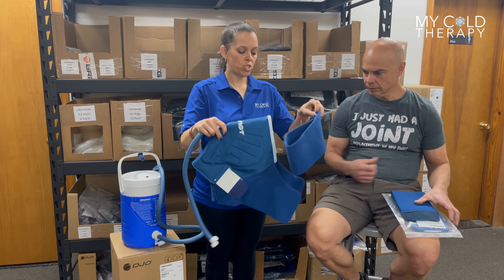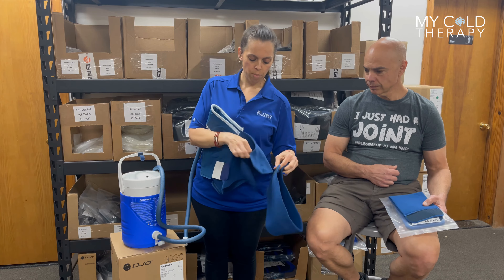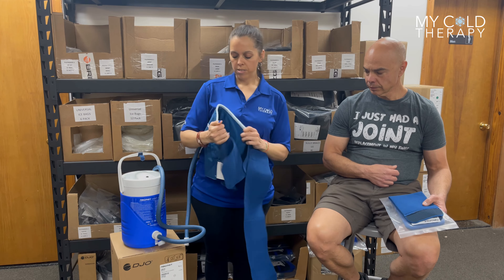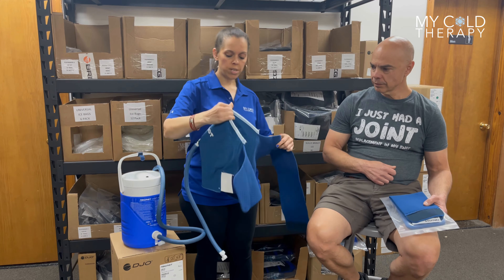Then you're going to take the long strap and apply it to one side of your pad. It's adjustable also, so it's okay if it's not tight enough or snug enough when you first put it on — you can adjust it to however you need it. Then you're ready to go ahead and apply the shoulder pad onto the person. Bring the long strap around and fasten it.